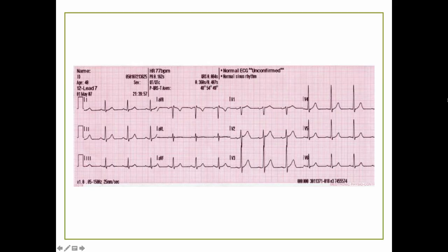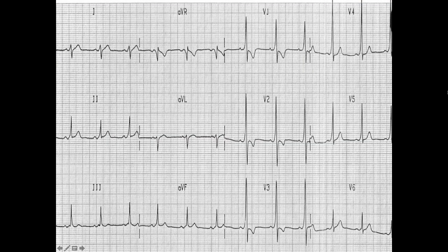So something's up. Finally, EKG 4, looking at R wave progression. V1 is mostly upright. Well, that's not normal. That's not a good thing. Okay. V6 upright. Well, that's a good thing. But wait, V1 is upright. That's not good.